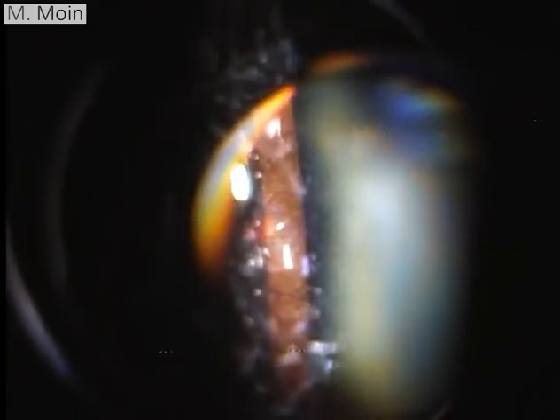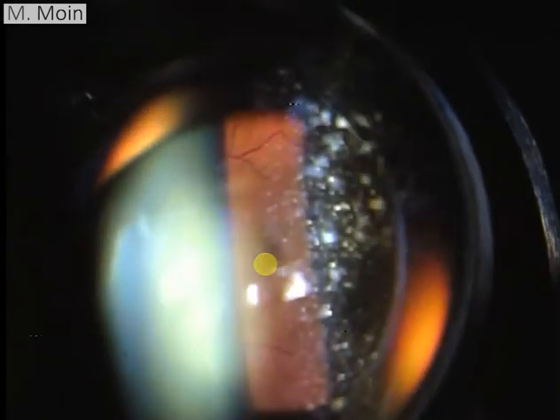This was a relatively young patient, so you can see the shine much more clearly, but this is what you need to see. The cup to disc ratio is about 0.3 in this patient. This is the patient's right eye, and you're going temporally. The patient actually had a retinal detachment secondary to multiple holes, and there was also a macular hole which seems to have opposed pretty nicely after silicone oil.